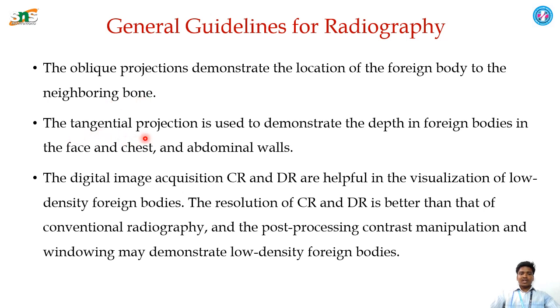Then the tangential projection is used to demonstrate the depth of foreign bodies in the face, chest and abdominal walls, and also in the skull bones where small needles are injected into the skull. The tangential projections are highly efficient to visualize the foreign bodies.